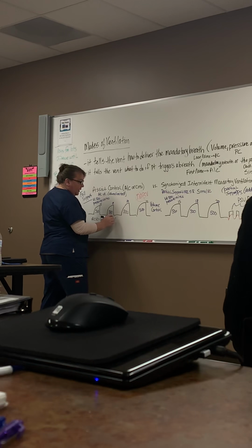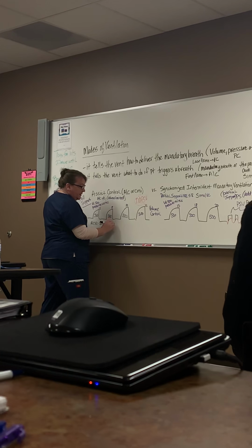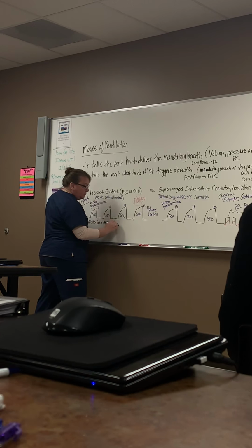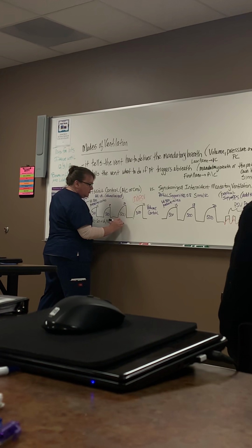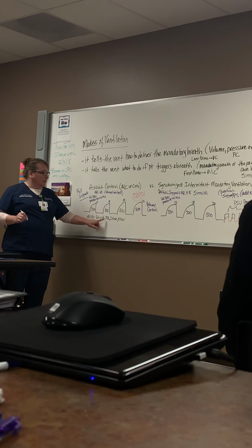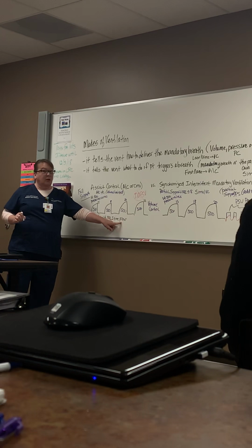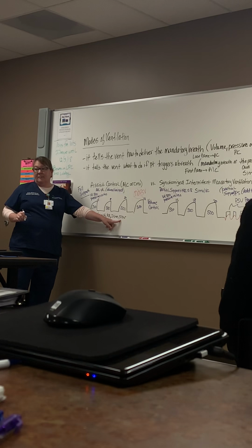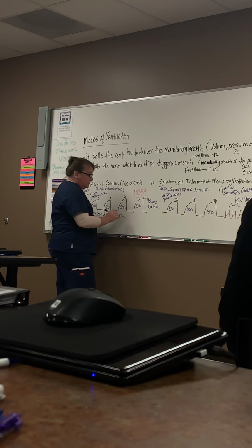So what else? We need to set our I time, right? What else did somebody say? Flow. Rate? I got the rate. Tidal volume, rate, I time, flow. And the other one, which some vents you can set and some you can't, is the flow pattern.